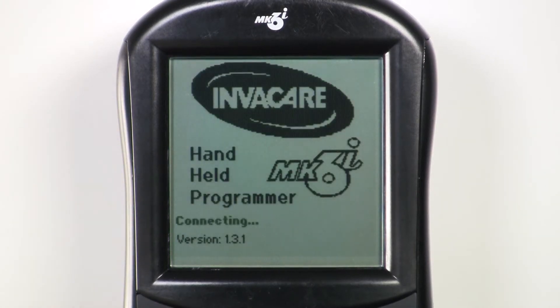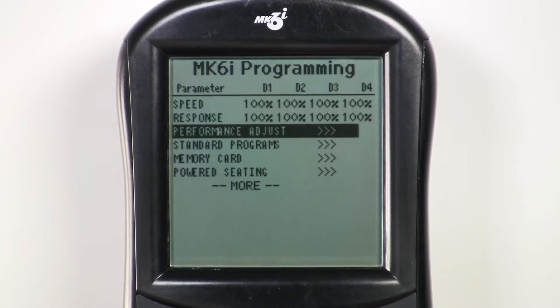To program latched type, plug the programmer into the chair and turn the chair on. Then turn the programmer on. Scroll down to performance adjustment and press select.